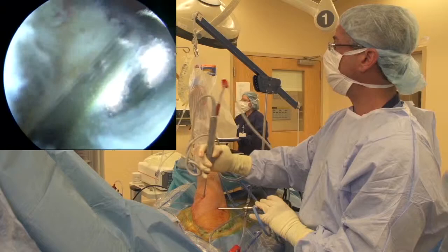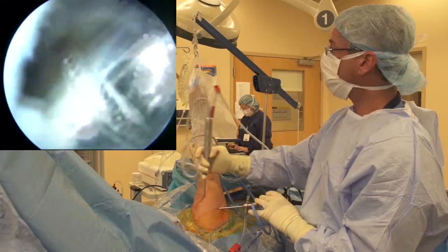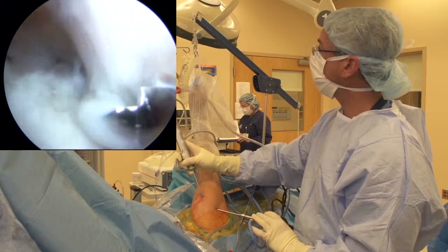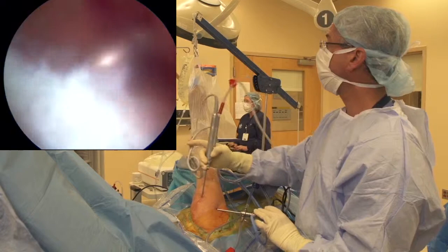I'm going to roughen and prepare this bed. I don't like to decorticate because we do want to have a nice strong construct for our anchor to gain purchase. Now I'm going to do a double row technique, so I like to take out the synovial fold here in the bursa and make it a little bleeding.